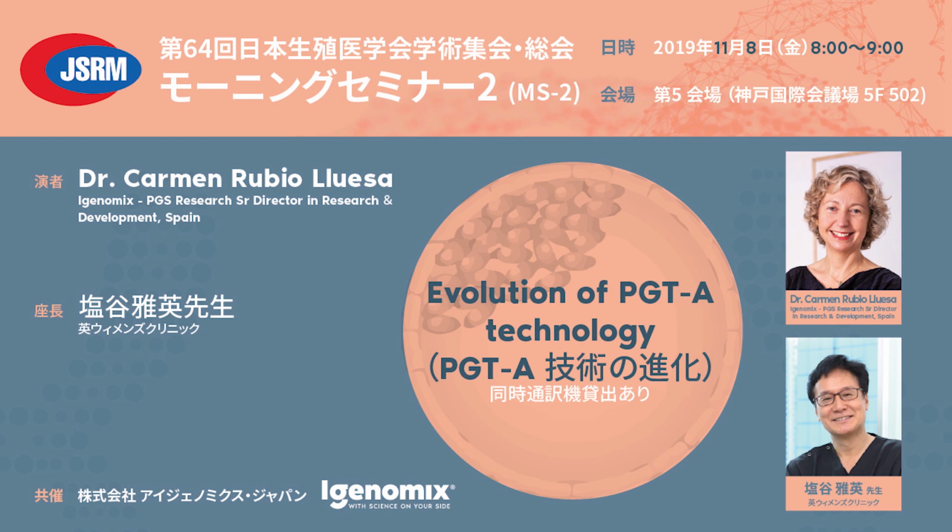Our experience with most of the labs is that if you don't do the assisted hatching on day 3, if you don't touch the embryos, usually on day 6 you have early hatching blastocysts, but not completely hatched blastocysts. In our first study, we only had 3 out of more than 100 that were early hatching blastocysts. The other ones were cavitated or expanded, but they were of nice quality.